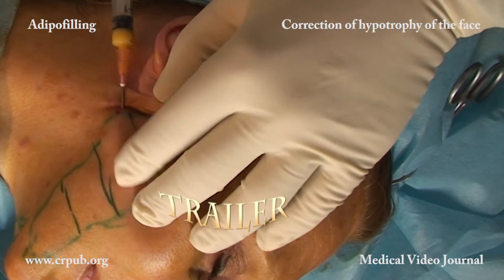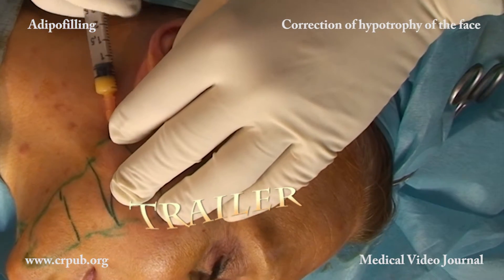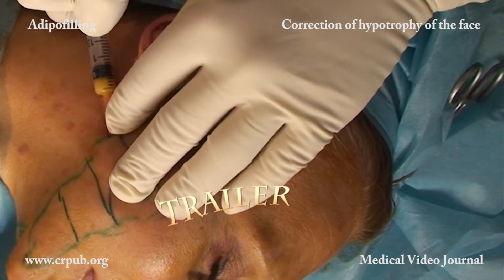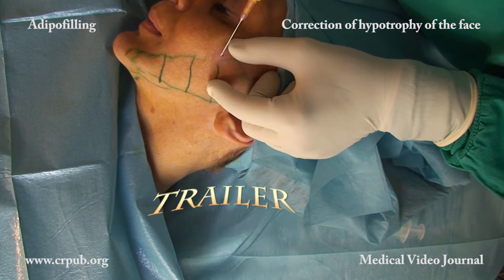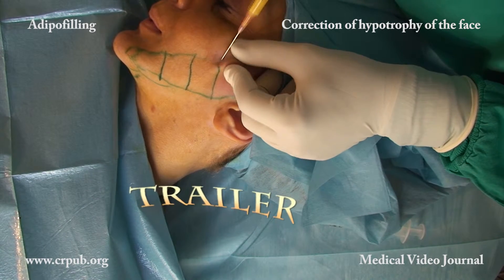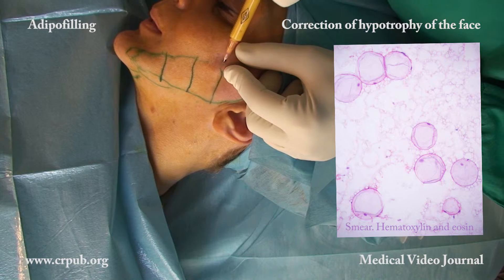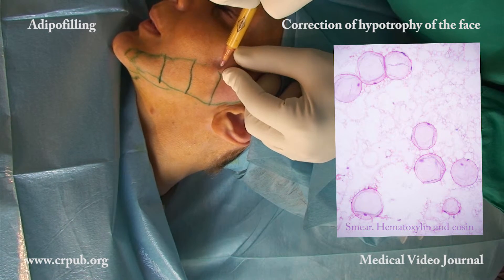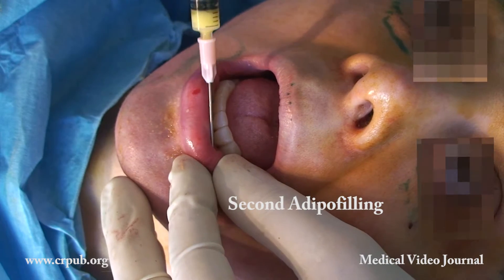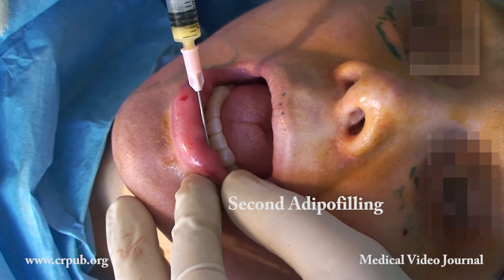As we have already said, with adipofilling, unlike lipostructure and lipofilling, there is no need to create numerous tunnels. Because the adipose and stromal cells are small, they spontaneously spread into the spaces in the subcutaneous tissue.